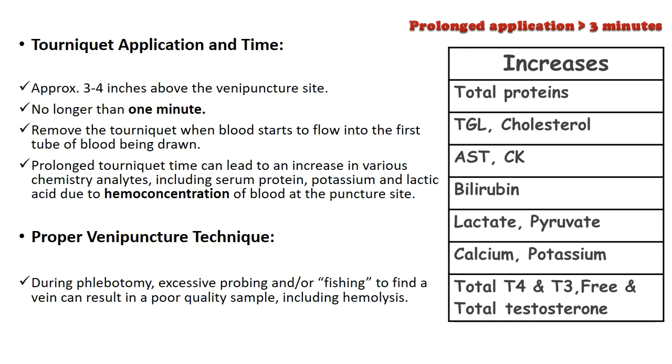I have seen a common practice during audit that when the phlebotomist is pricking, the blood is coming through a closed evacuation system. The ideal rule is that whenever the first blood comes to the first vacutainer, there is no further importance of the tourniquet. You can release the tourniquet, because the aim of tying a tourniquet is just to engorge the vein. Once the blood starts flowing, there is no need to keep it tied. But I have seen that till the end of the collection, people keep it tied.